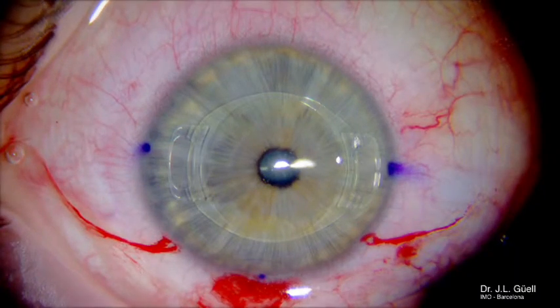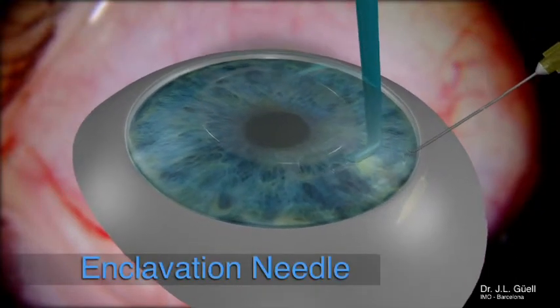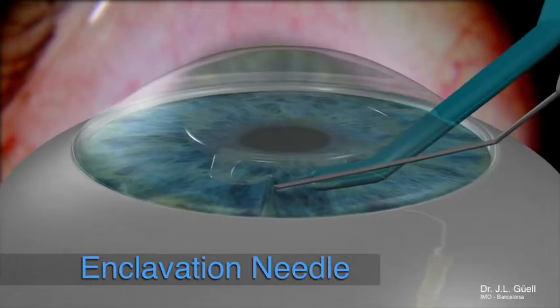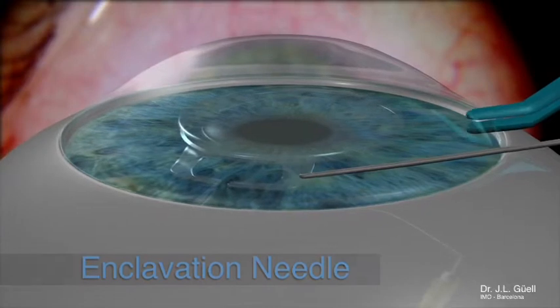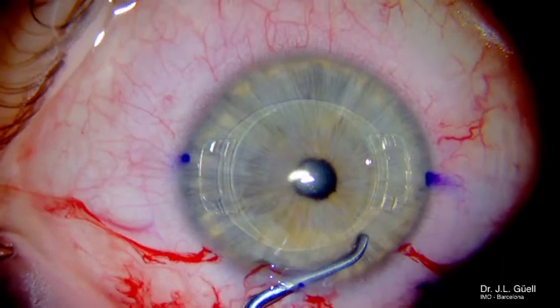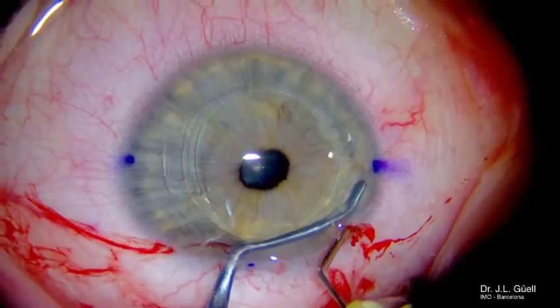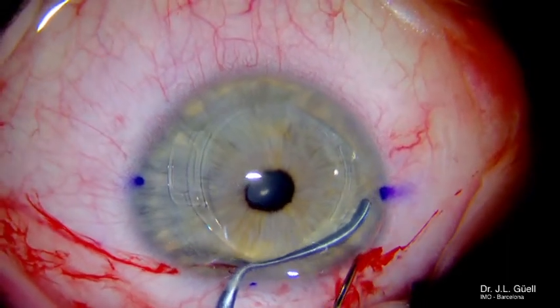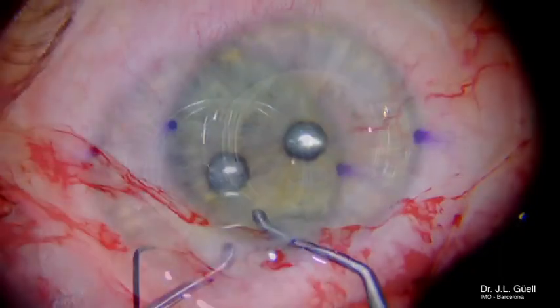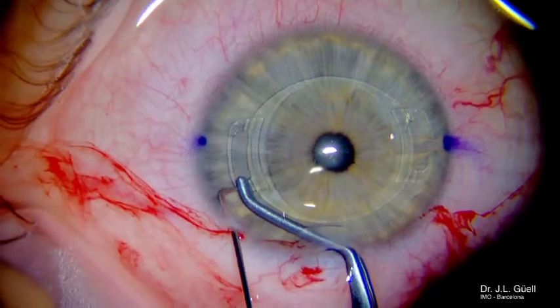This is another example where you will use the enclavation needle. As you can see in the diagram, we gently introduce, in a similar way, a couple of folds of iris inside the claw. But doing that maneuver, we should take into account that the iris we grasp is a little bit proximal to the final positioning of the IOL because of this about 5-degree rotation. So using the needle in toric implantations is a little more tricky than using the VacuFix.